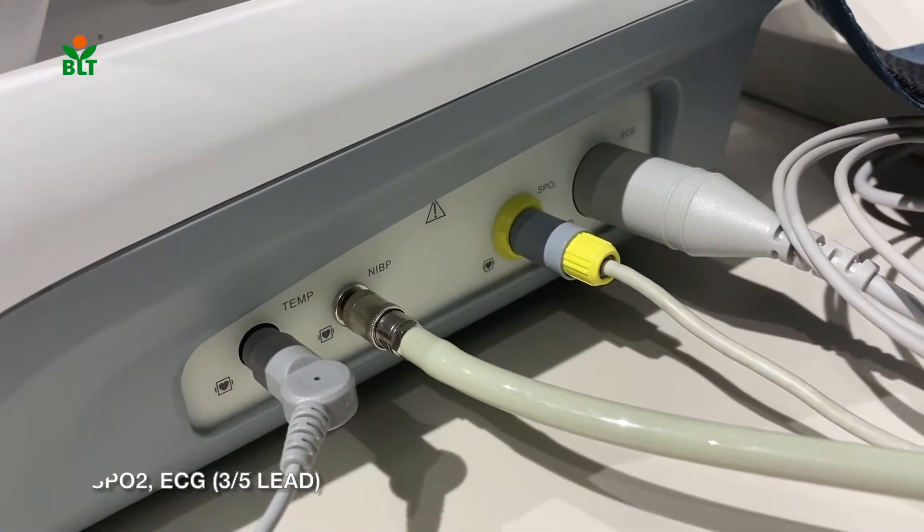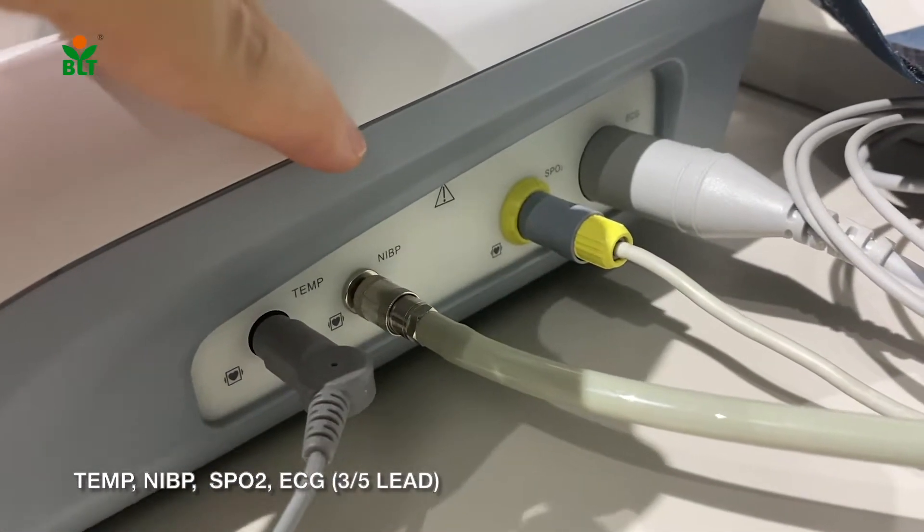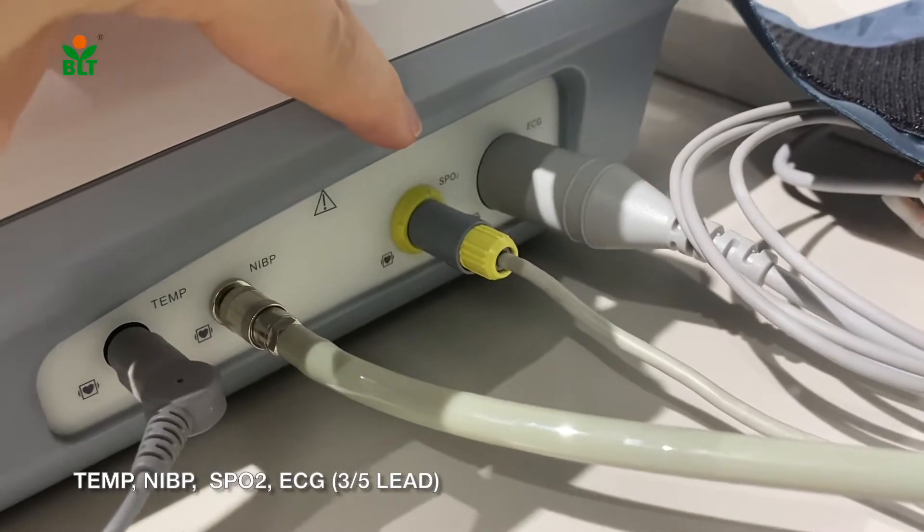On the right side of the machine we have the temperature connector, NIBP connector, SPO2 connector, and ECG connector.